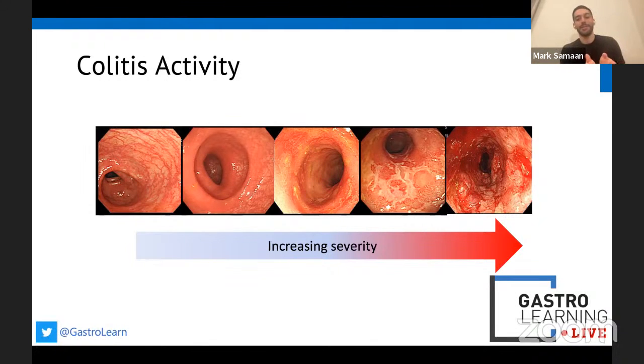Of course, these are the patients who go into trials, and in trials, some of the entry criteria include a full colonoscopy, and indeed there are endoscopic colitis scores that involve a full colonoscopy. There's a colitis score that does exactly that. So I don't want to overburden people with concern that they're going to cause harm if someone's got ulcers.